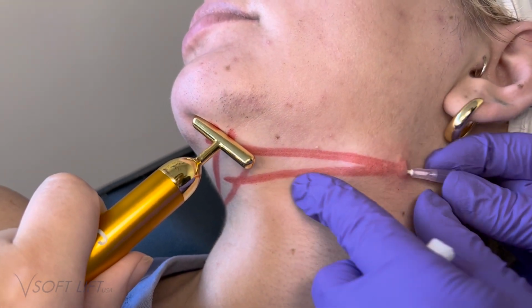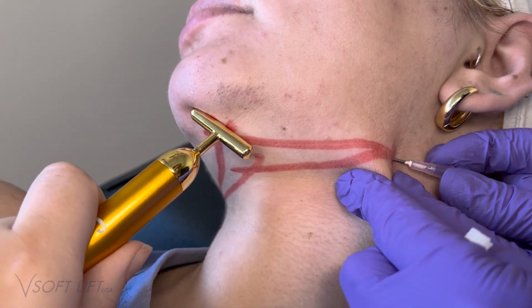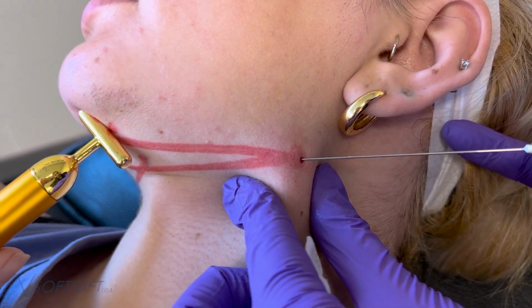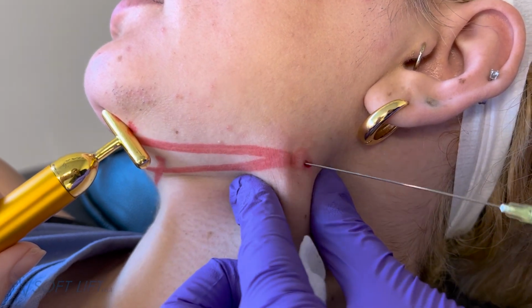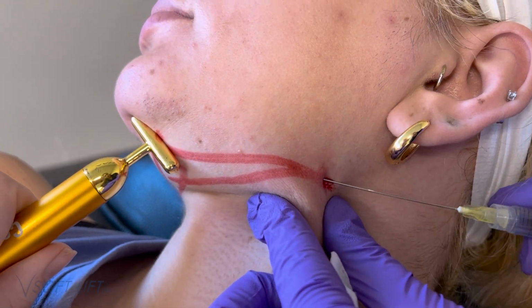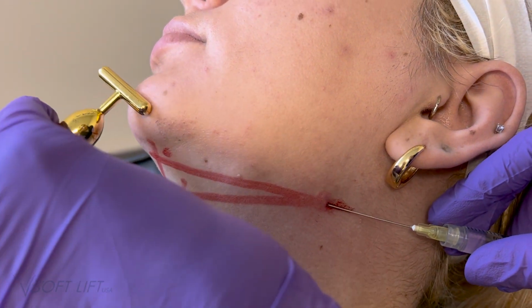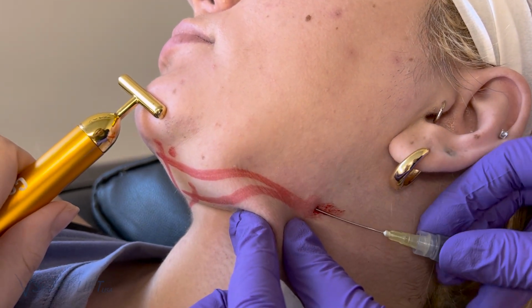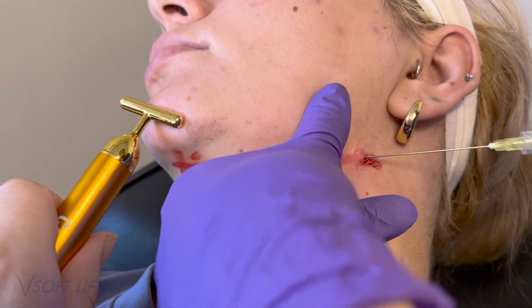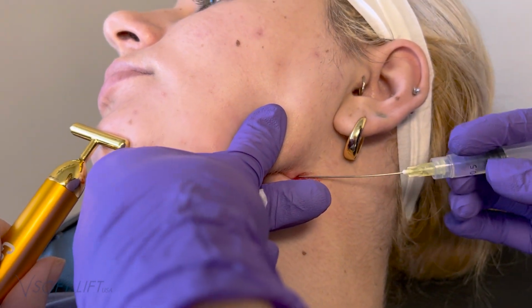For her as well, I am doing the very best that I can, but also letting her know that the best results are going to come with time. Granted, I will get instant results with PDO thread lifts, of course, but I'm not necessarily going to get the full results, and I also need to be really patient with it. She's the perfect patient for this in the sense that she's really good with post-care, bruising and swelling, and communicating, so I have no concerns about trying threads and filler at the same time.